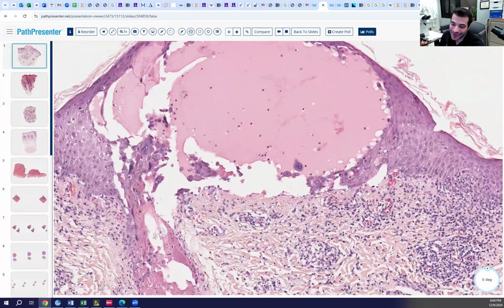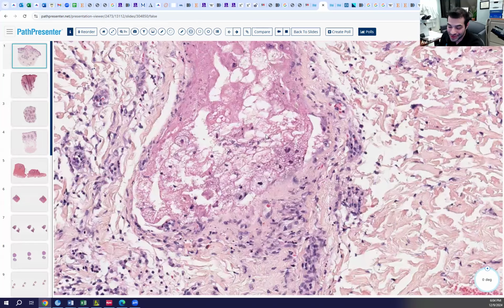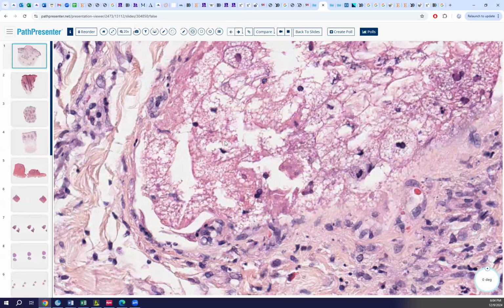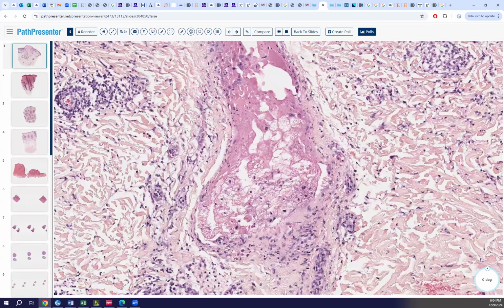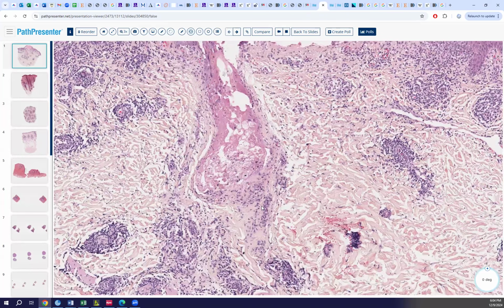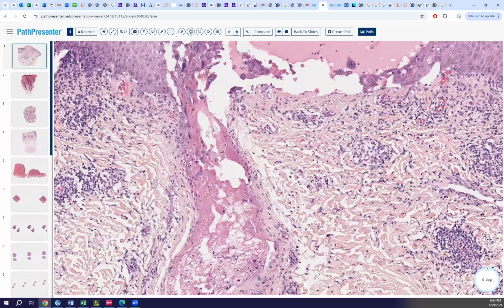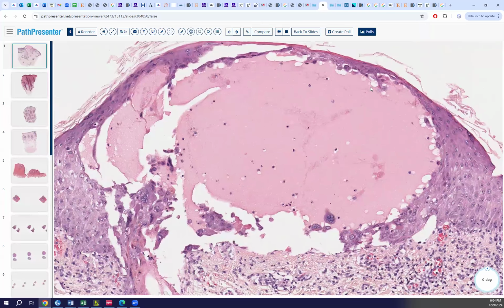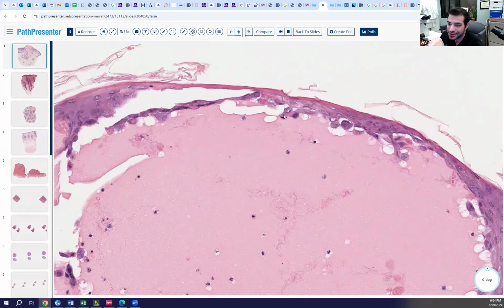The point is herpes can infect the hair follicle and can destroy your sebaceous glands. So this would be follicular herpes. If this were regular acne, we could see a vesicle with neutrophils, but not necessarily the multinucleated marginated cells we saw, and maybe not necessarily the destruction of the sebaceous gland either. If it were just neutrophils here, it would just be a pustule.